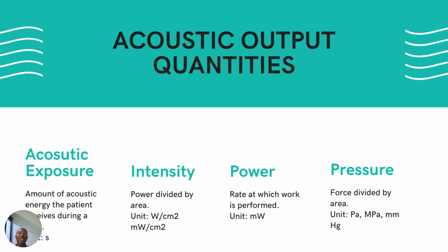There are some acoustic output quantities that we need to understand, because if ultrasound is a form of energy, it needs to be measured. These quantities are what we use to quantify the amount of acoustic energy that gets delivered through the probe into the patient. They are acoustic exposure, intensity, power, and pressure.